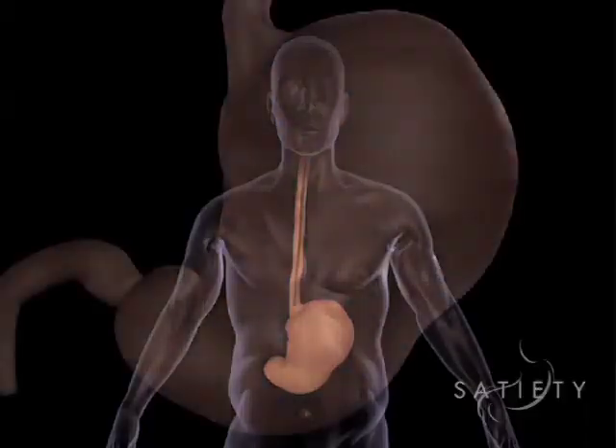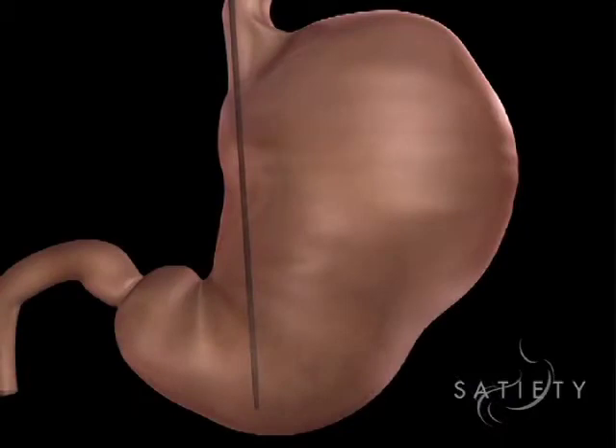The first step in the process is to do a standard endoscopy, just like is done thousands of times probably a day across the country, where we look inside the stomach and make sure that the anatomy of the stomach is relatively normal and make sure the person does not have a large hiatal hernia.